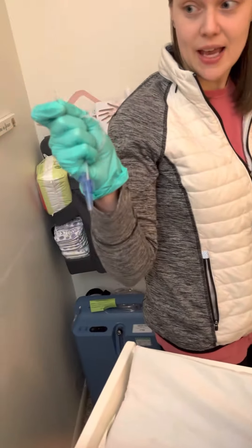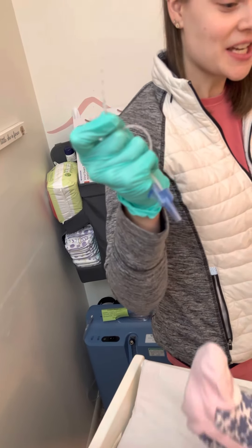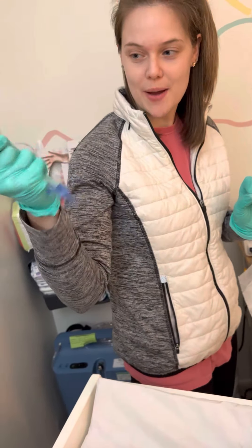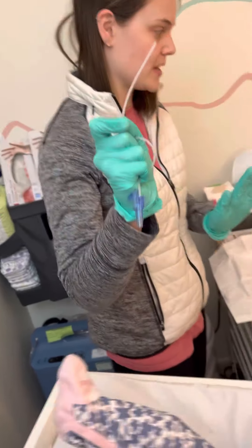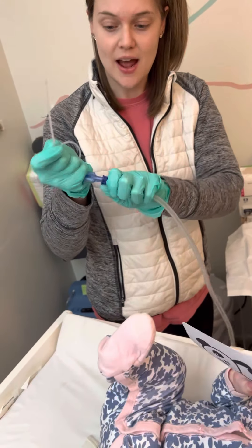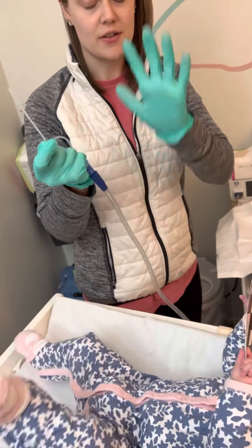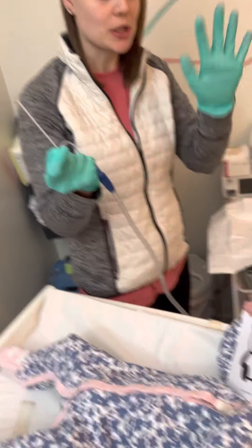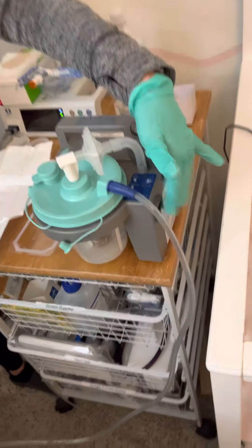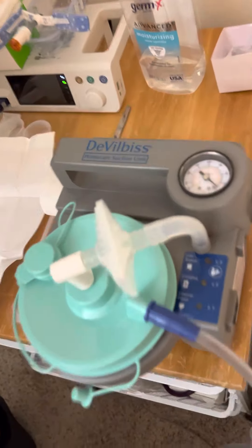If it's helpful, you can wrap the catheter in your hand because she likes to grab it now, and if she grabs it it makes things a lot harder. Keep this wrapped and away from anything else. Then with your other hand grab the suction tubing and stick it on the end of the suction catheter. Since you've touched other things with that hand, it's considered dirty — use that hand to touch everything else. The on switch is right here; flip it on and we go to a hundred.